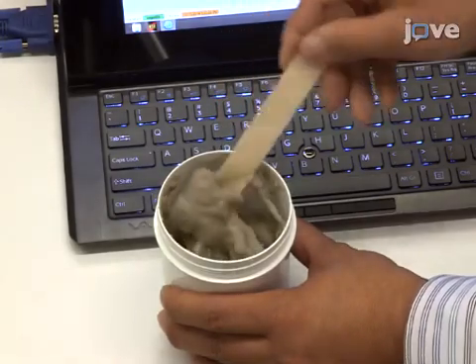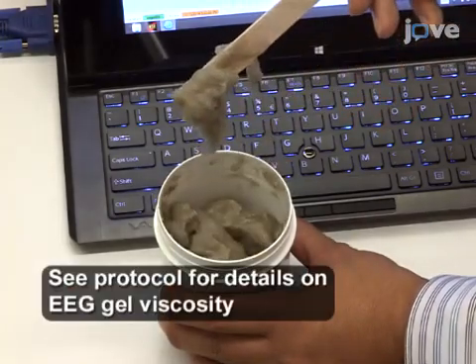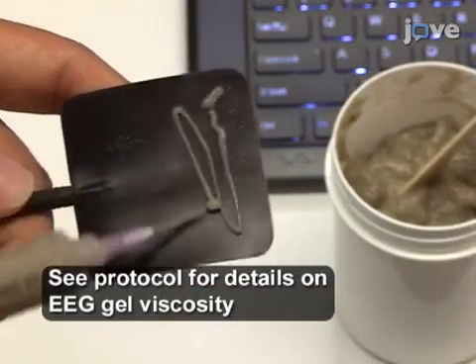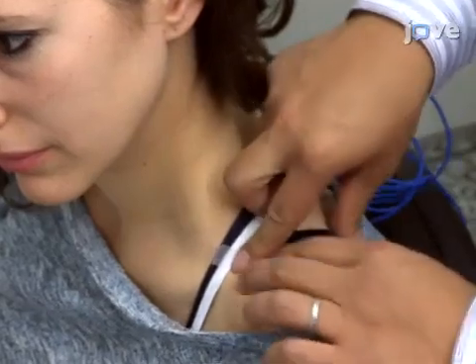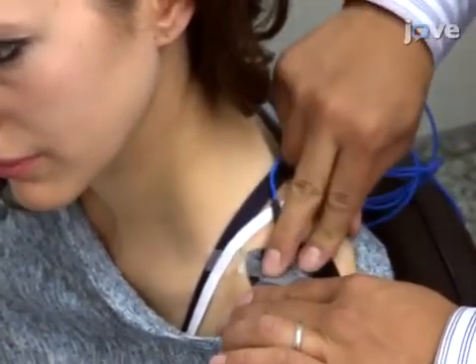Apply EEG gel with appropriate viscosity on the TACS electrode and place the electrode on the shoulder. Secure the electrode on the shoulder with adhesive tape.